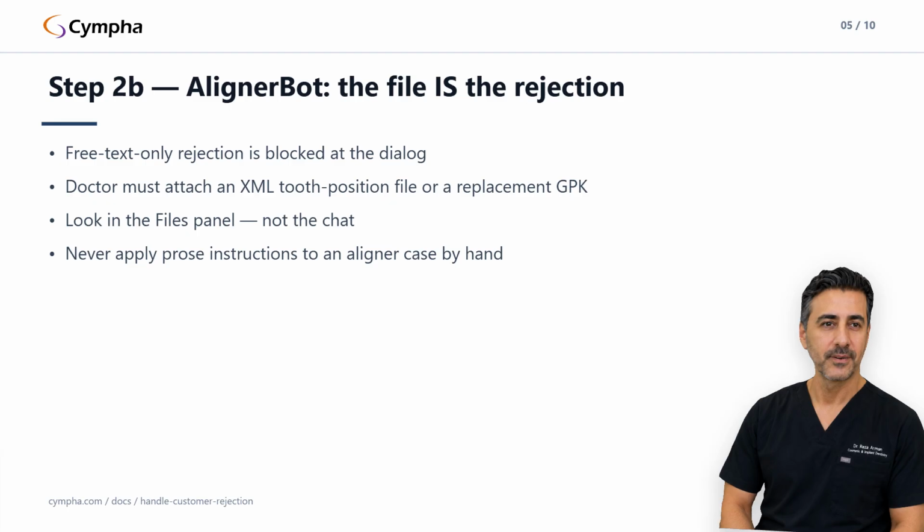The OrthoPlus Planner Cascade has no English parser. Pushing teeth by eyeball defeats the deterministic second round. Ping the doctor and ask for the structured file instead.